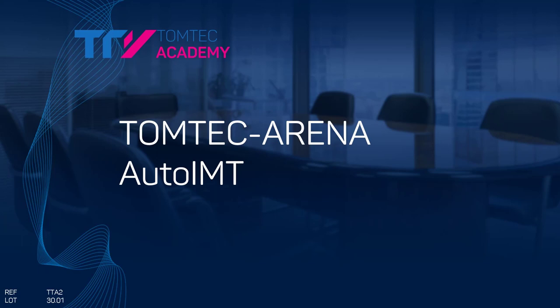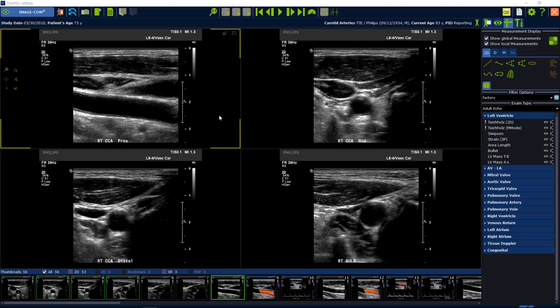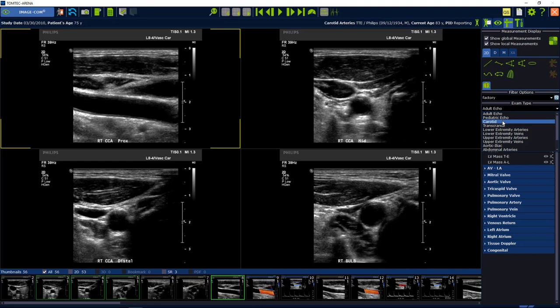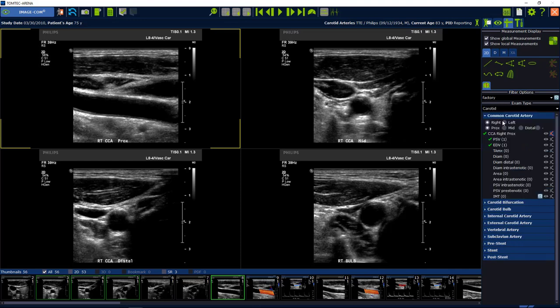Today I want to show you how to use AutoIMT. Start from Imagecom and select a vascular image. Then open the measurements and here select the right measurement package. In our case it's the carotid.